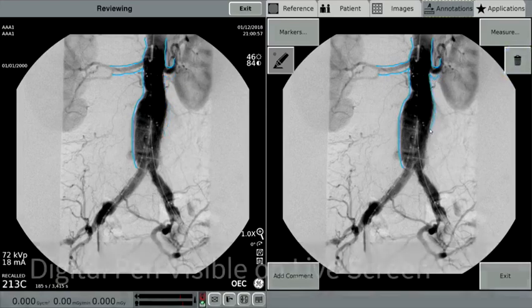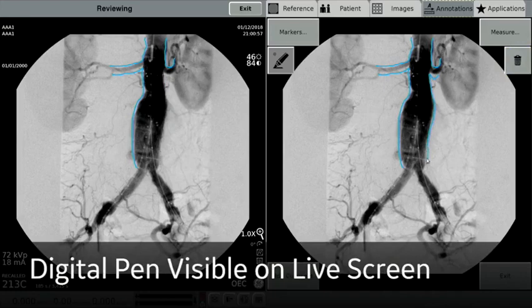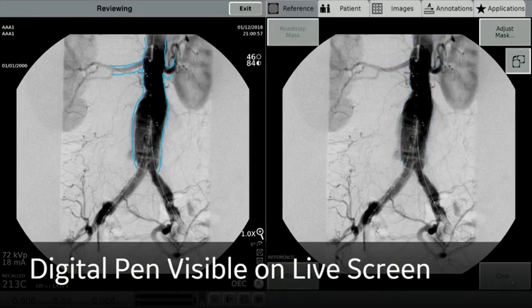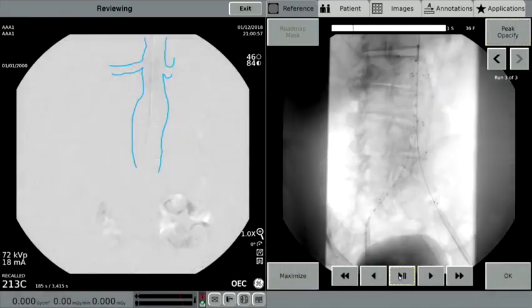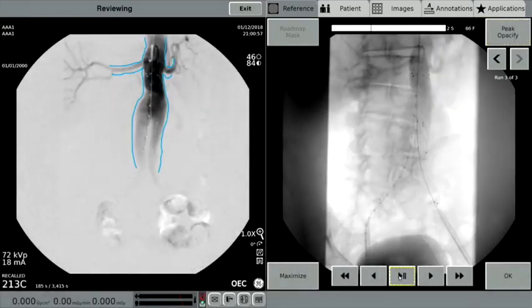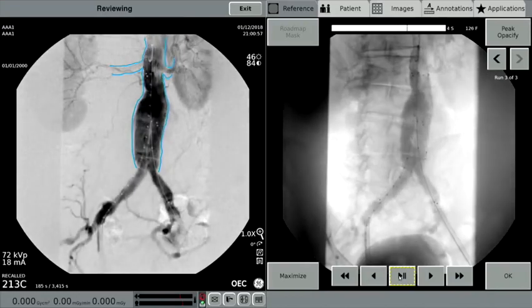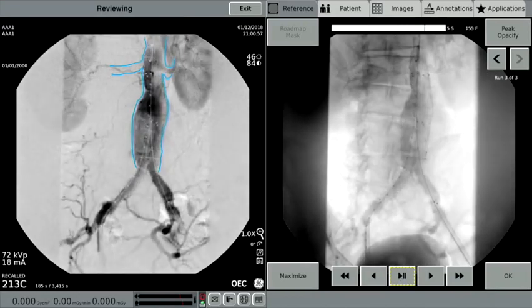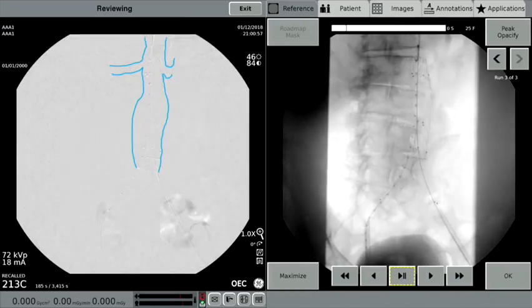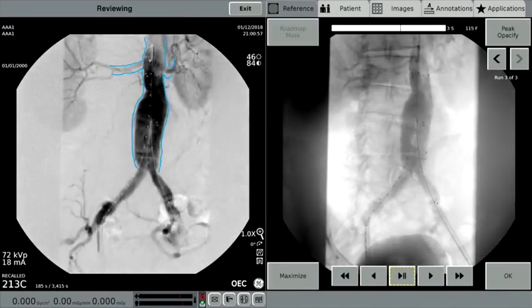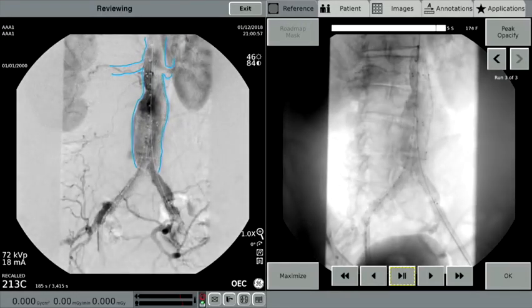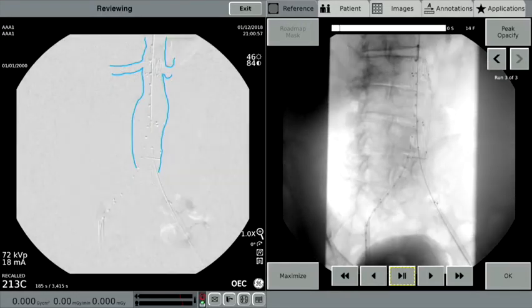Lines can be edited by selecting the trash can icon and will be deleted individually as drawn. Once drawn, the digital pen lines also appear on the left screen and will remain on the live screen during subsequent fluoro shots. Here, a cine run is being shown with the digital pen lines on the live screen. It is important to note that the patient and table must remain still and unmoved for the digital pen lines to remain accurate in future fluoro shots.